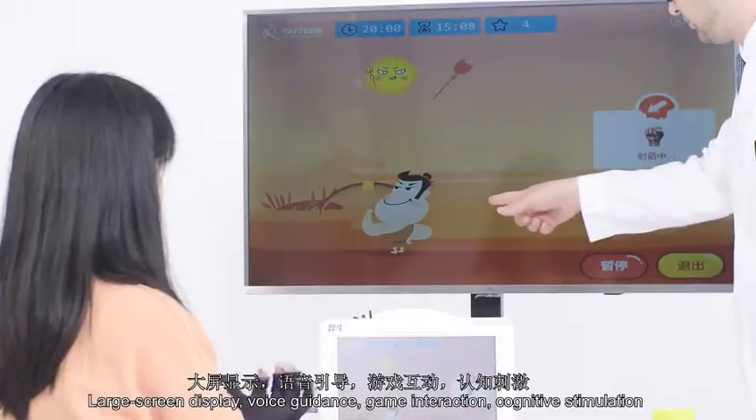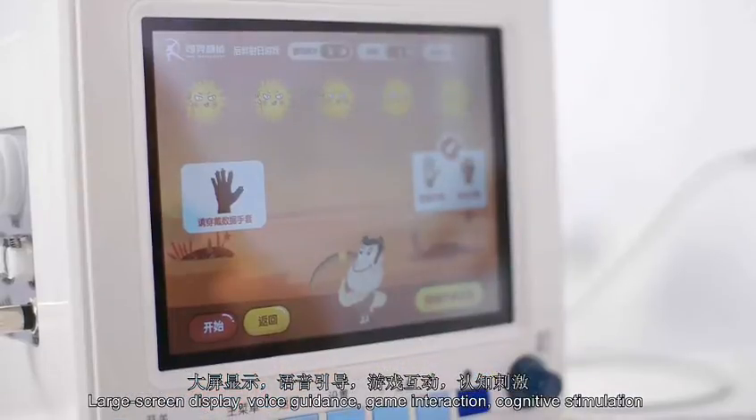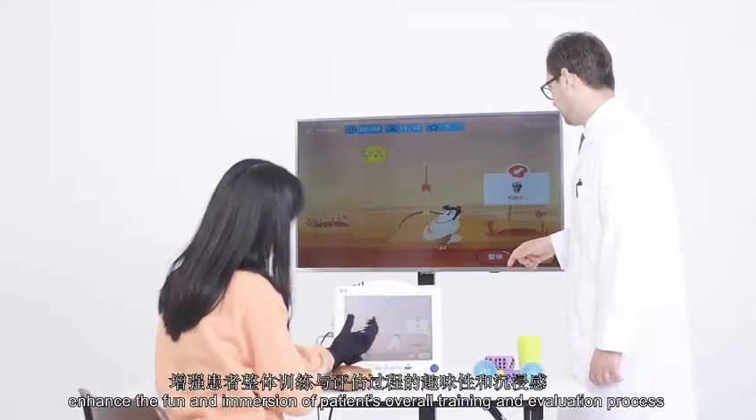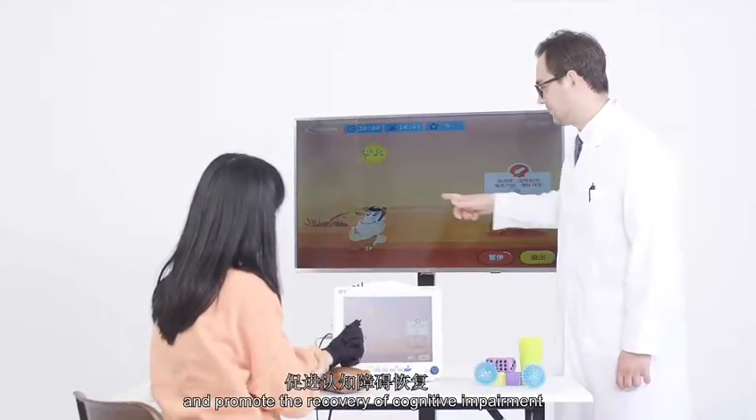Large screen display, voice guidance, game interaction, and cognitive stimulation enhance the fun and immersion of the patient's overall training and evaluation process, and promote the recovery of cognitive impairment.